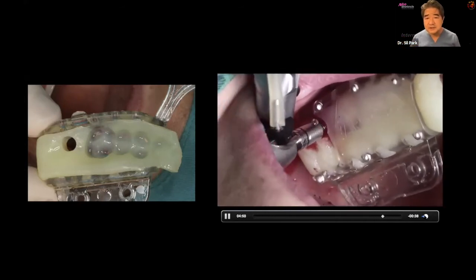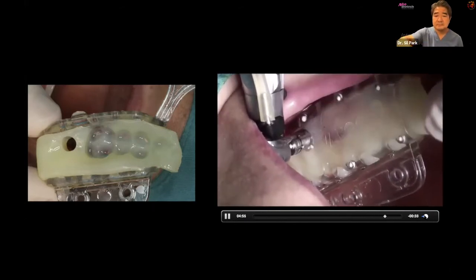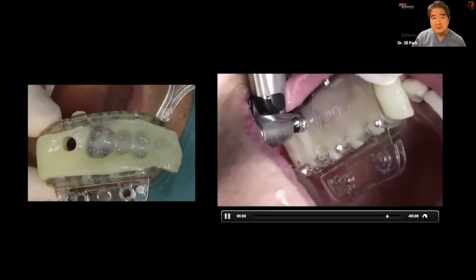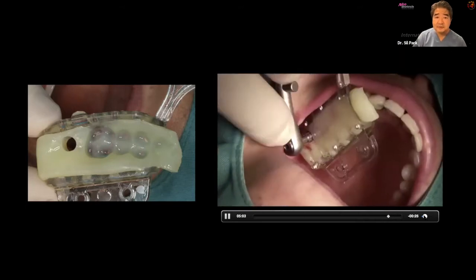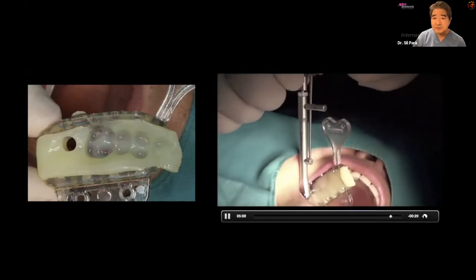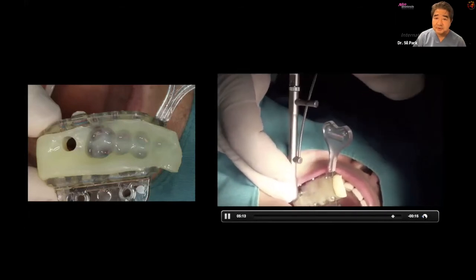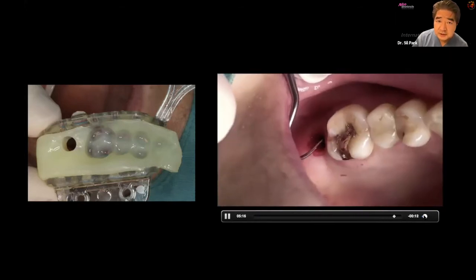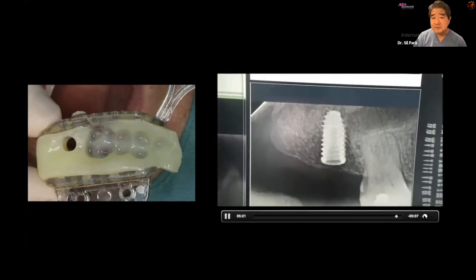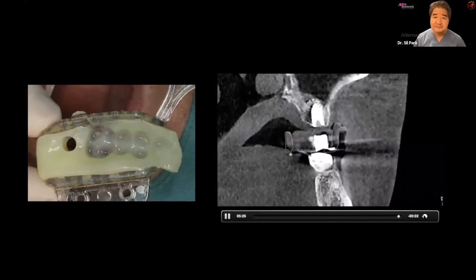So the IX3 implant is placed using the VARO guide, as you can see over here. Right, so once the fixture is in, you can do the final torque with a manual wrench, get the right position, and also check the torque, as you can see over here. The torque is about 40 Newton in this case, because we achieved bicortical fixation using the sinus cortical layer too. So this is the end result.